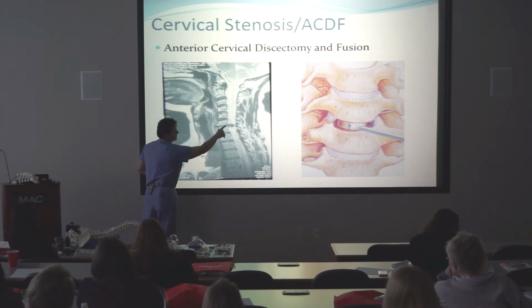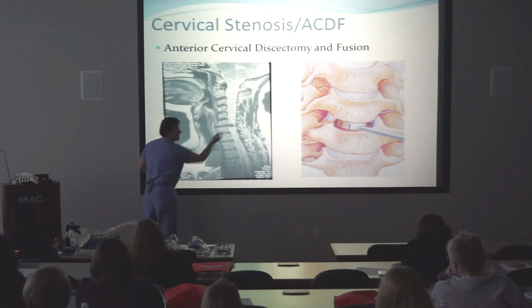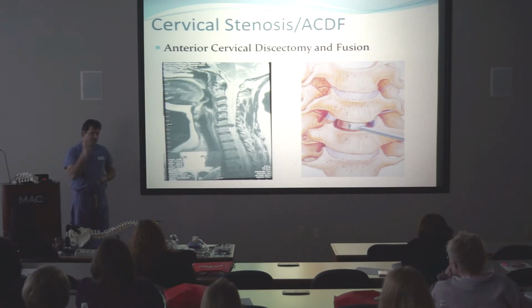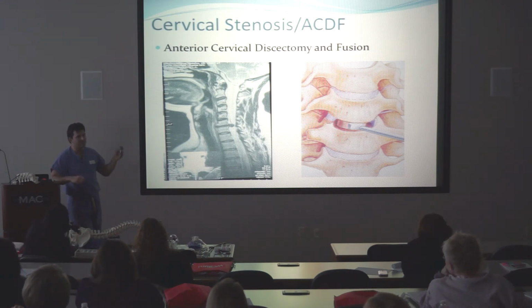So then what you do is you have a special instrument that hooks underneath the corner here, and then you have a really small biting instrument, a kerrison, that has a little foot plate, and I'll show it to you up here, that you use to bite off that little corner. But you gotta make sure you don't burr down too far, obviously, because you got problems. So that's always the stressful portion of these cases. If you're back there burring, you're burring next to the spinal cord. It's one of those things you can just take your time, no rush. Make sure nobody's bumping the table or any issues like that. But you try to be real safe about not getting too close to it. So it takes training.